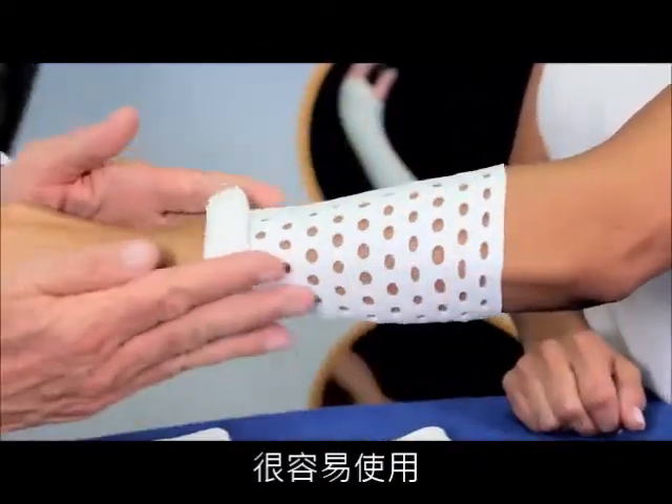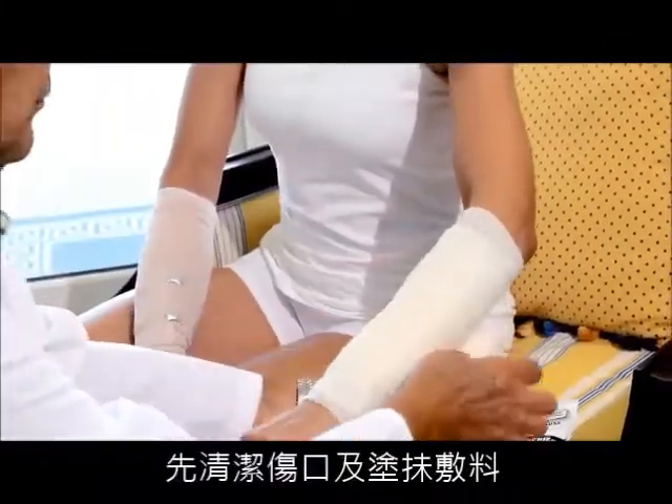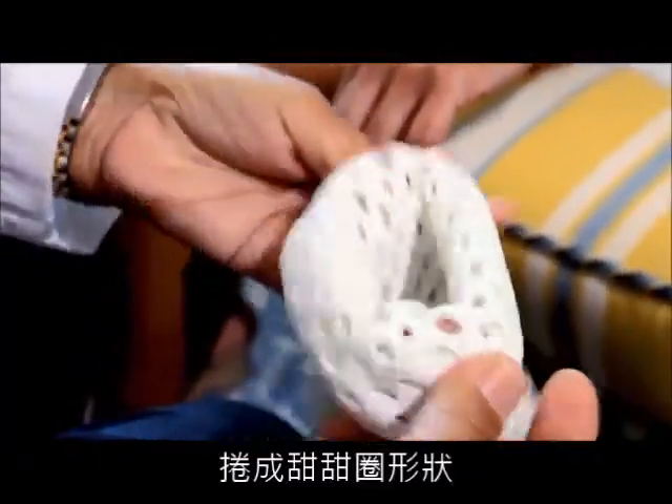So easy to apply — New Bandage is a padded bandage system. Clean and dress the affected area. Hold New Bandage vertically and open the top end with both hands. Roll the bandage up, creating a donut shape.